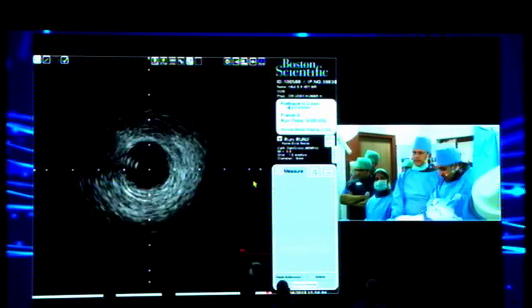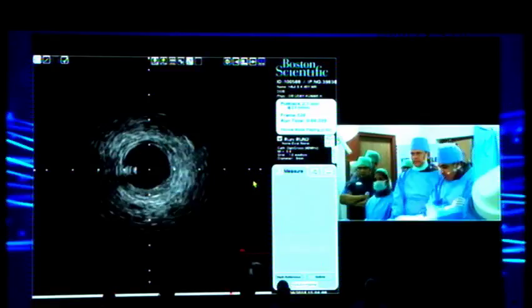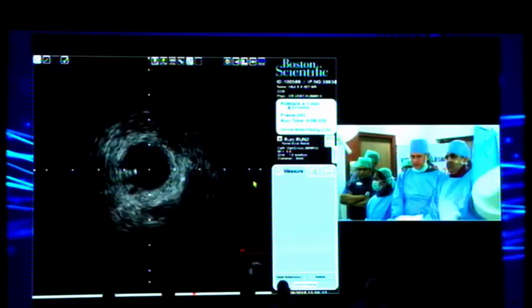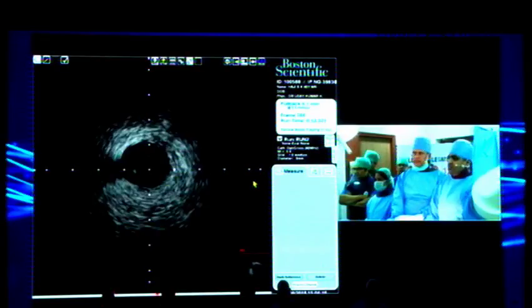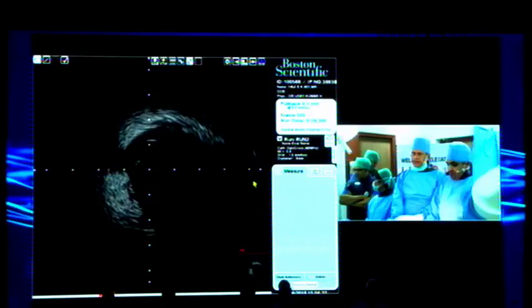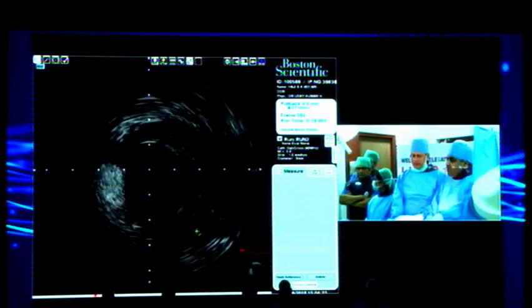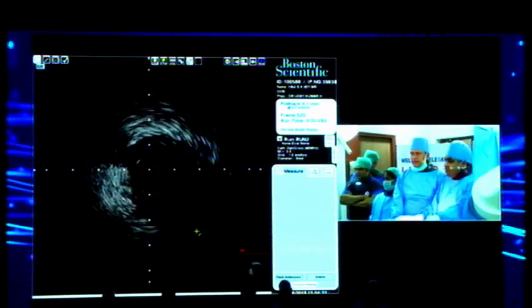Yeah, actually, I want to ask about this. Only 1 week back the patient attended CTO PCI. Just now we had a discussion, and we think that usually with the septal perforator some problem occurs. Is the ideal time to do it within 1 week? That is the first one. And the second one: if the septal perforator is responsible for the failed PCI, would you like to concentrate much more on the antegrade, and then, as you already suggested, IVUS guided puncturing of that, you wanted to do it?